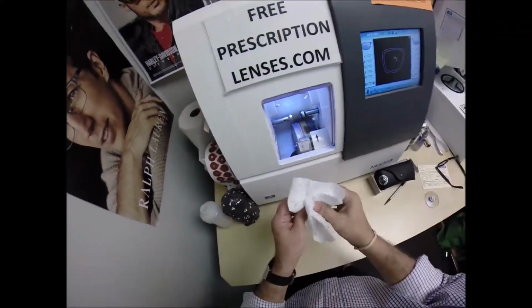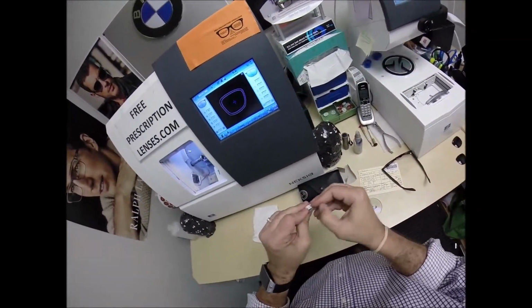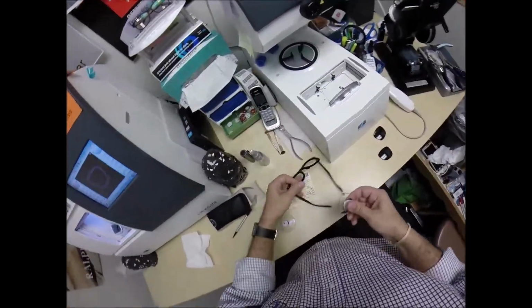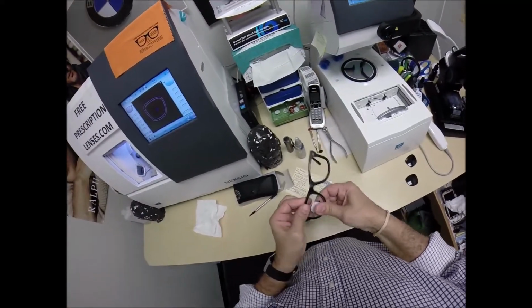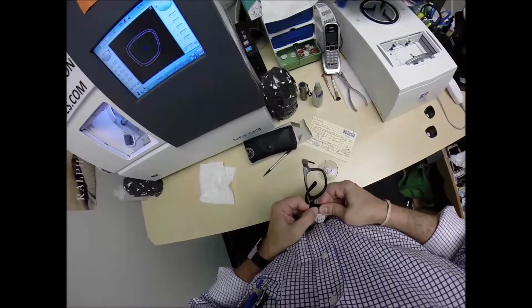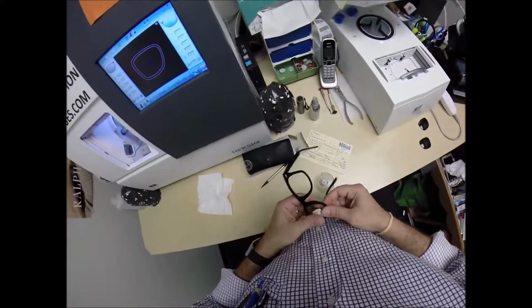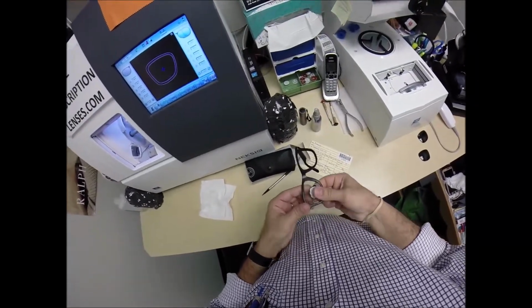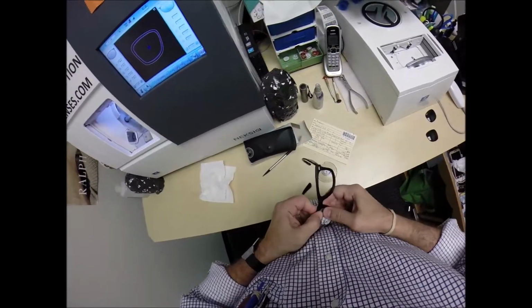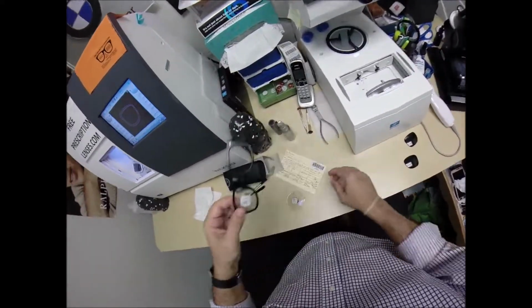Take the lens out, dry it off. Check for any optical sawdust. We're good to go. Tuck the lens in at the outside corner. Push down, come on now. Make sure everything is in place. There we go. Now we're in there. Now we're cooking with gas.